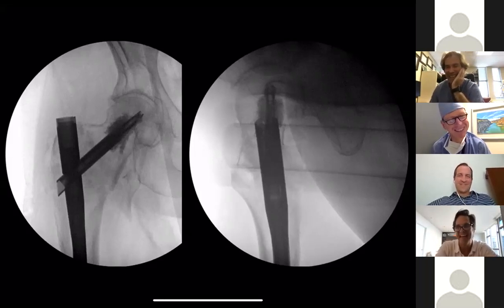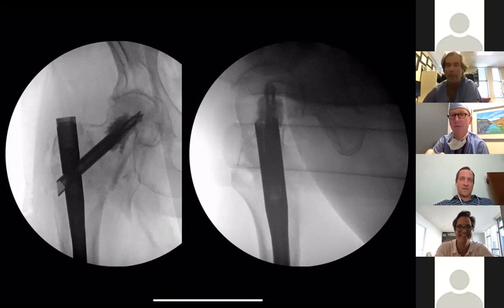Yeah. All right, so you're right here. A number of these devices, regardless of brand, have something where you'll spin a knob and it'll try to drag the blade plus the cement now, which is a more sturdy object. It'll try and drag that lateral. Did you try that? Very reasonable. We didn't in this case, but very reasonable. I agree with you. And we oftentimes try to do that to get some compression intraoperatively.